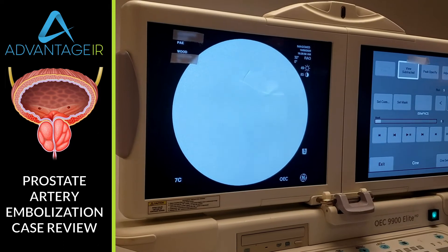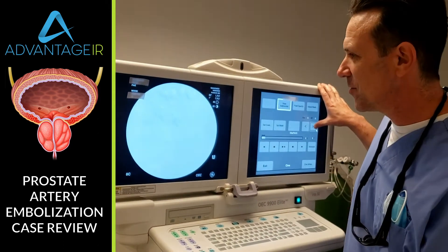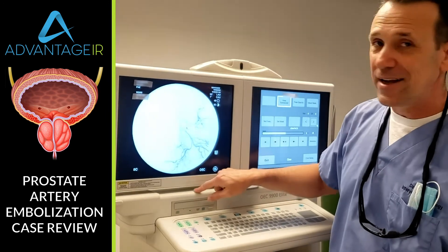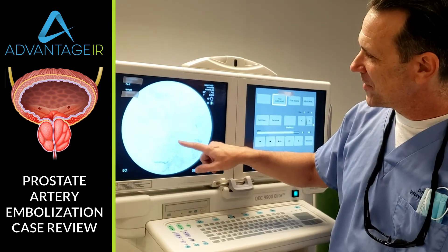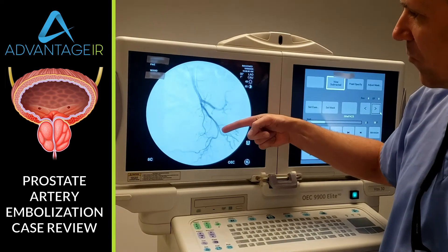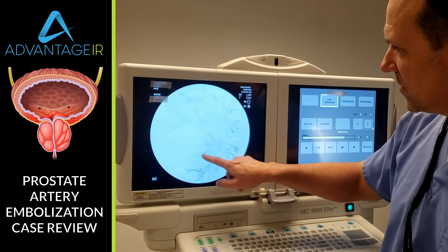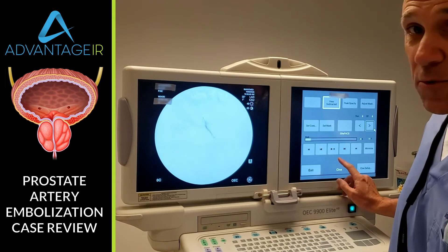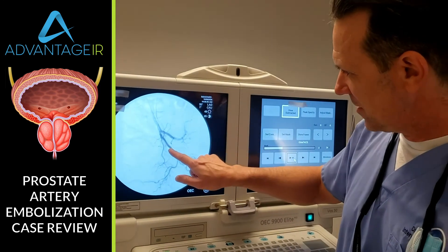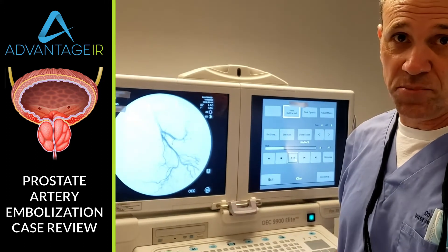Now we treated that side with the beads. We're going to go to the other side. This is the left internal iliac angiogram. You can see the contrast going in and getting washed out by the blood flow. And you can see the prostatic artery right there. Now we're going to freeze — and there's that left prostatic artery coming off the internal pudendal artery.